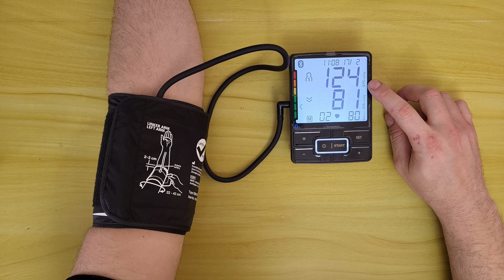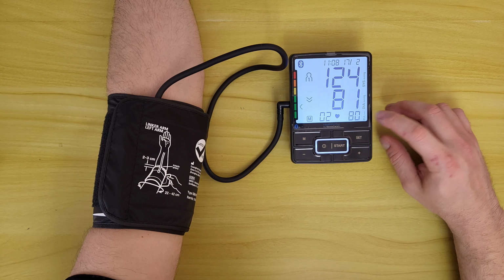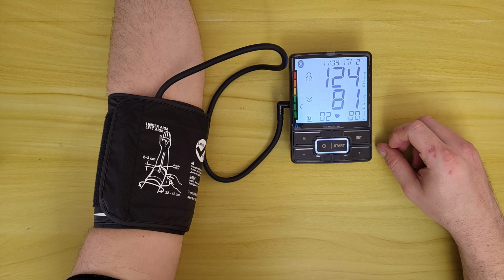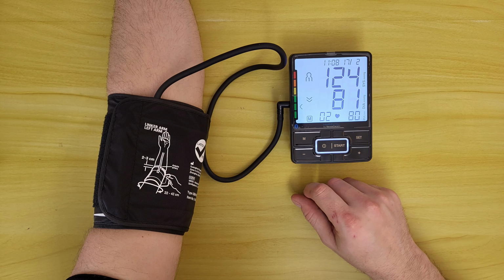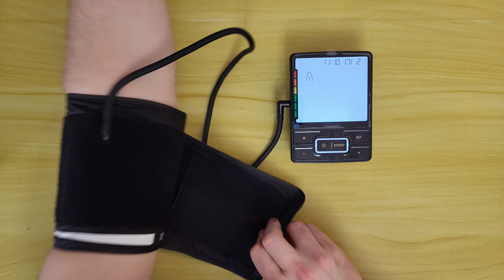And again, systolic, diastolic, the pulse per minute, second measurement. And we are in the second green, that means we're okay. Now let's remove that.